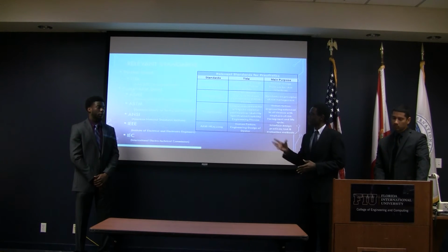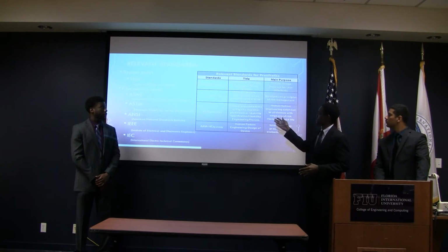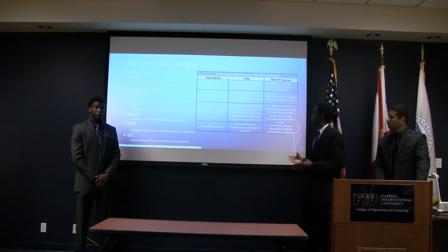Among these standards, some of them are pretty much created by two bodies. For example, these are some of the listings of requirements that we have to apply. One of the key factors here is general requirements for safety and essential performance. Usability specification is important. Usability engineering process.